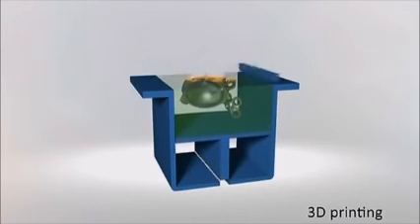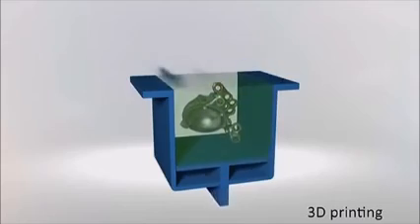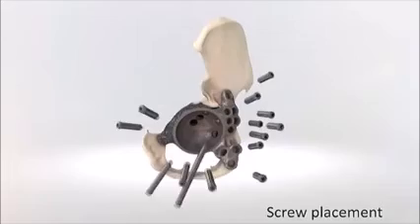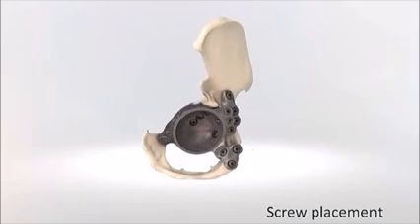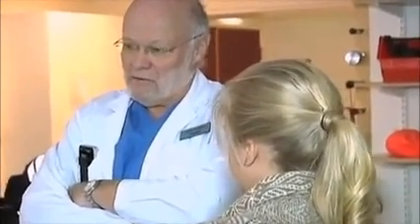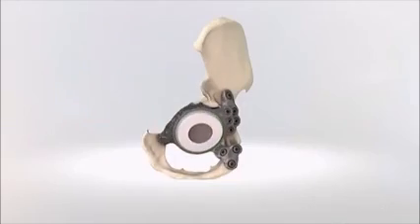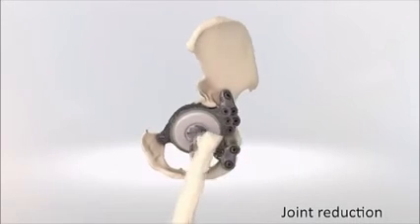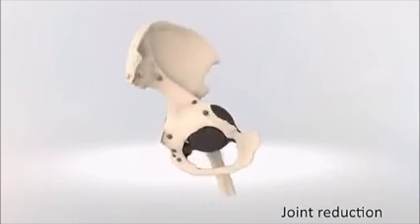The printed implant is created using a specialized tomography scan, following the patient's specific bone anatomy. Screw placement is also unique to each patient, based on bone quality. Falassian's surgeon, Professor Urban Riedholm, says Mobilife provided detailed instructions for the implants, and even though the surgery was challenging, he believes it was his patient's only hope for a life without a wheelchair.